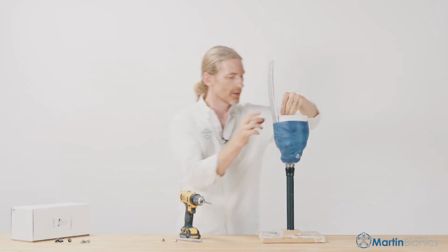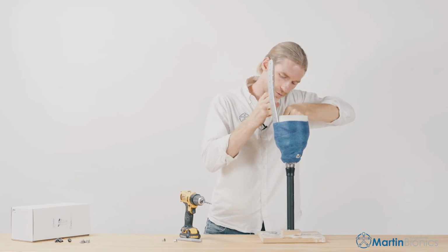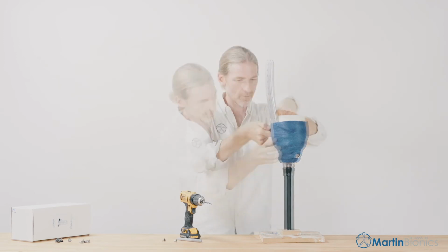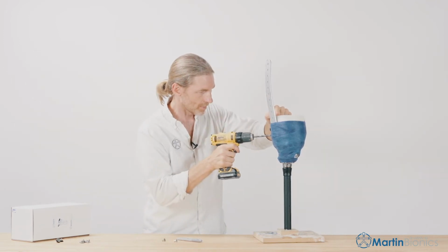Take my truss nut, put it through from the inside. Should go all the way through all the layers. Good, sandwiched in place. I'll do my next hole.